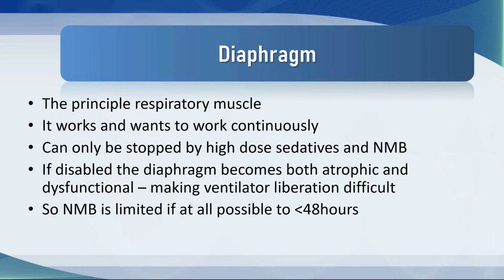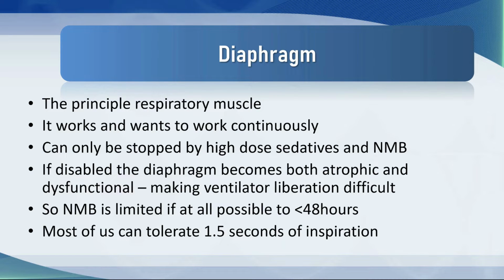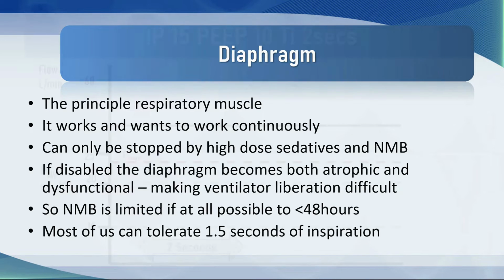As a result of this, we tend to limit the use of neuromuscular blockade to fewer than 48 hours, if at all possible. Moreover, it's important to also understand that when we are delivering pressure in inspiration and holding it there, most of us wish to exhale after about 1.5 seconds, and that becomes problematic.